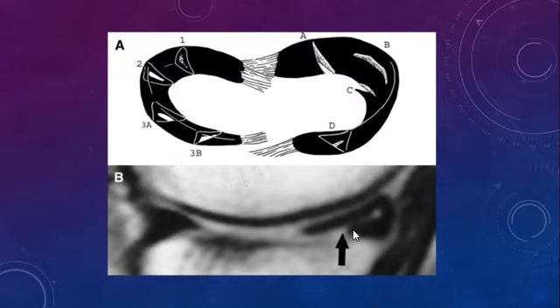For me, personally, I don't like to mention a grade 1 tear or grade 2 tear, because you never know if the person who will read the report is oriented with this classification or not. I prefer to describe the tear and mention that there is an oblique tear involving the posterior horn of the medial meniscus, for example, extending to the inferior or superior articular surfaces of the meniscus, or even might be a complex tear extending to both articular surfaces of the meniscus.